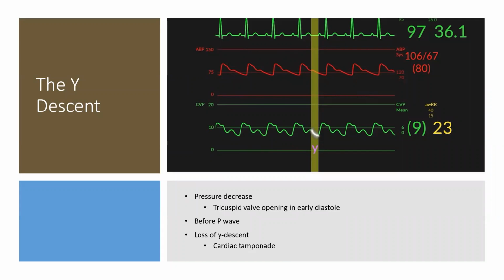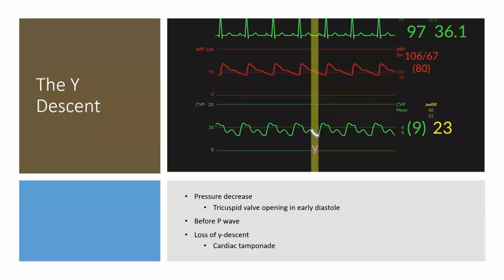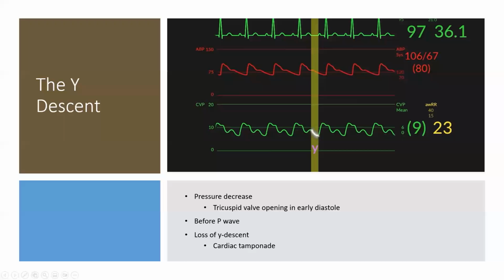Whenever I teach critical care, my students, who usually are nurse residents and new graduates, say, so why do we have to bother looking at all these waveforms? And I say, if you have this number, you need to understand where those numbers are coming from. You want to make sure that the machine is inscribing correctly.